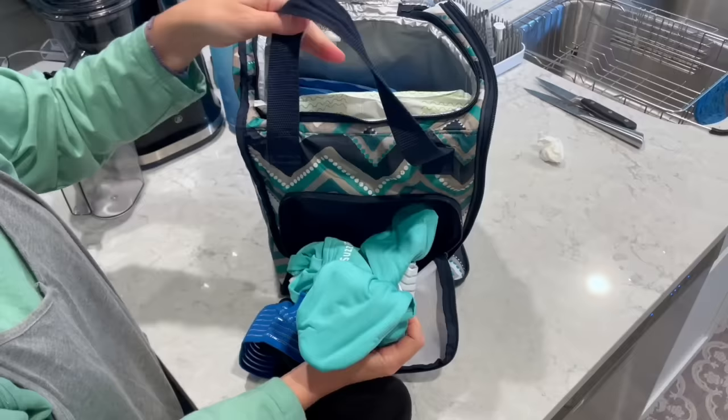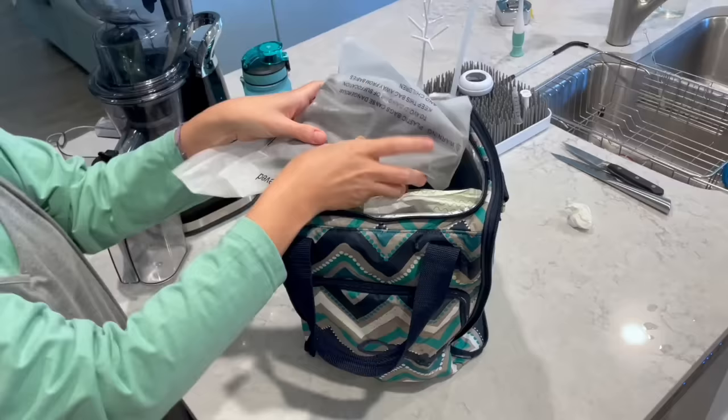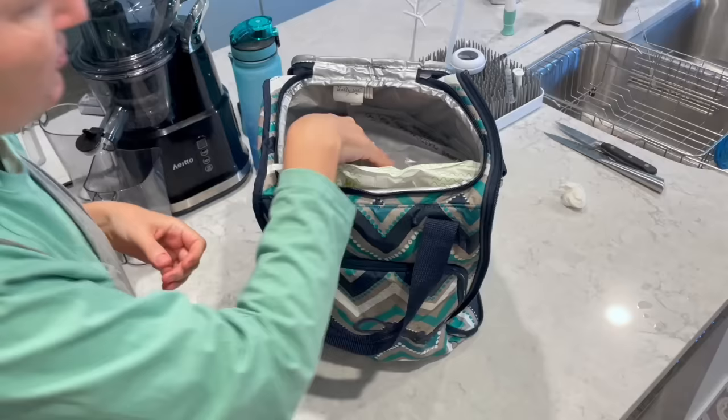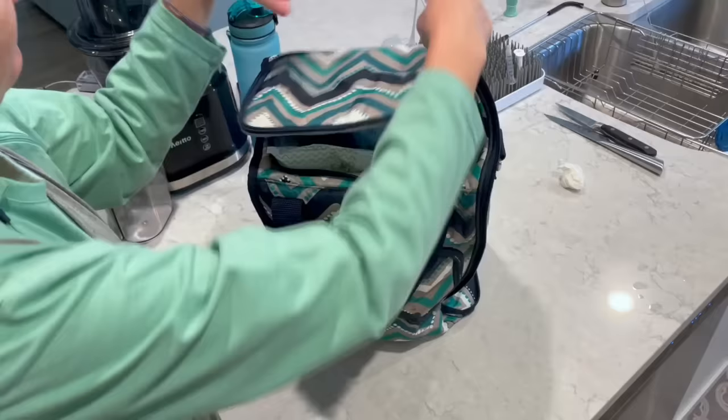So ice packs and ice caps are ready to go. I usually throw coconut water in as well because, you know, electrolytes. Ready to go.